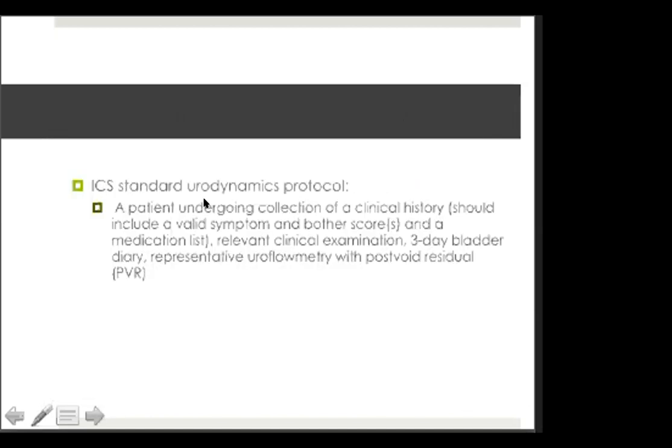So, for the ICS standard, in urodynamics protocol, Ernest? Yes, sir. Ano pa yung significance sa uroflowmetry? I mean, dun sa bladder diary. Other than yung sinasabi mo ng incontinence, what other information can you get? Basic information that you can get. Sir, pwede rin tayo makakuha ng kung gaano kadami yung output niya.